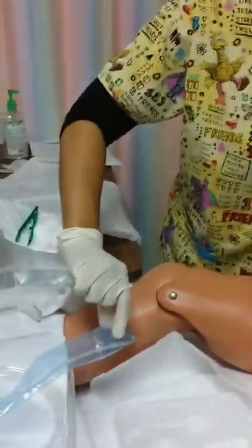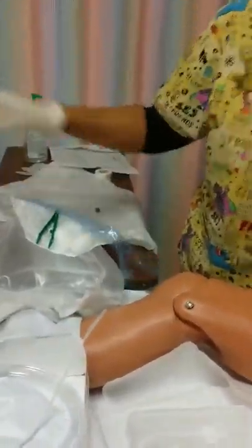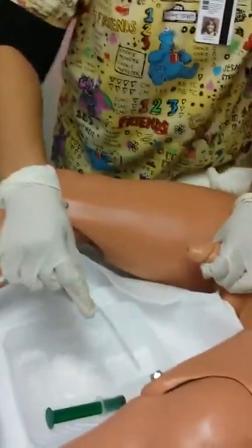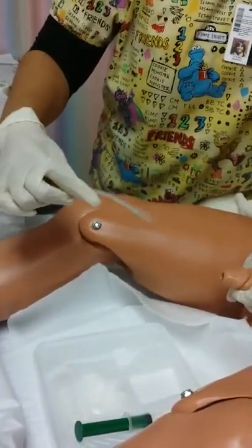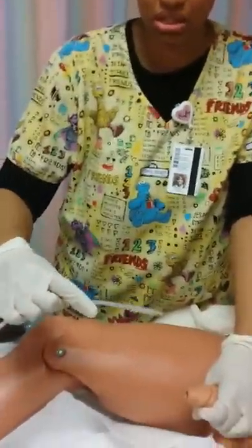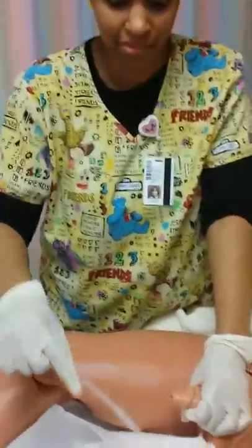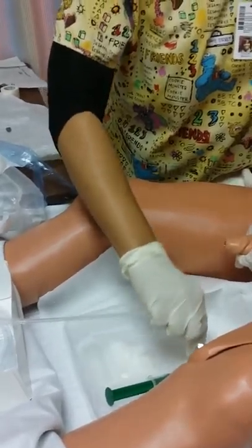So we'll go ahead and expose the tubing, because I'm ready for that. And then, as I stated, I went ahead and put my lubrication down. So that's already there. So they say, depending on how big the urethra area is, depends on how far you have to stick the catheter tubing. So I think they said 7 to 9 inches. We're going to do 7 today, okay? So we're going to go ahead and generously lube the catheter up, okay?